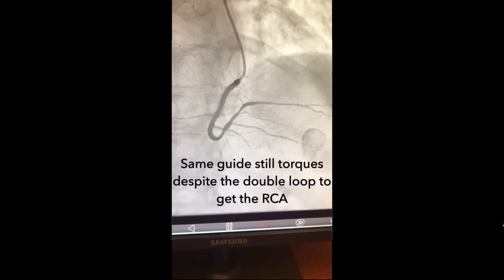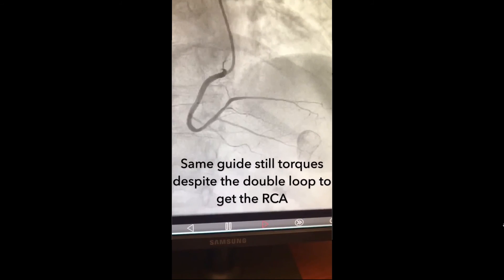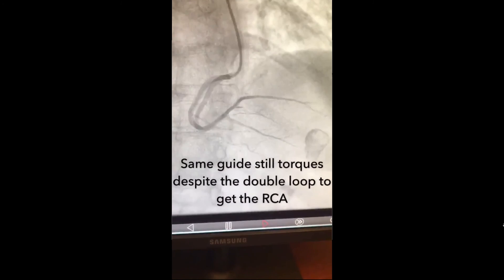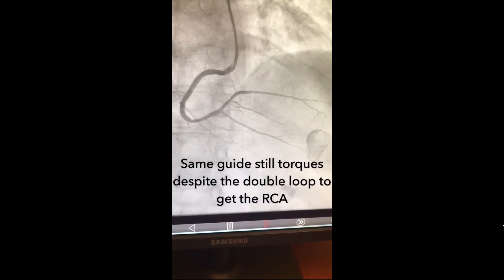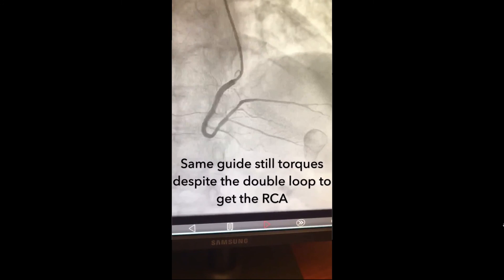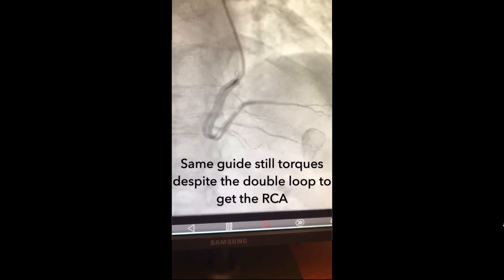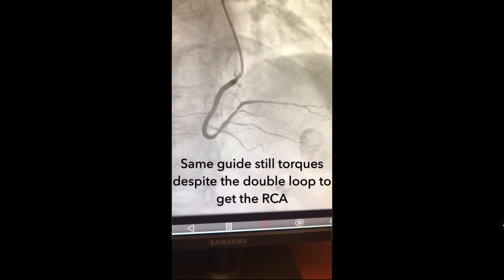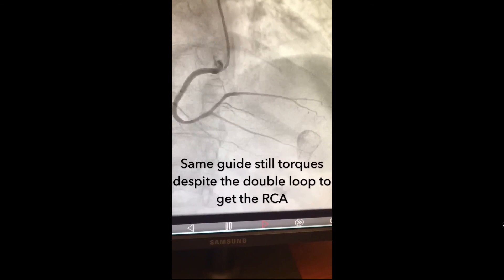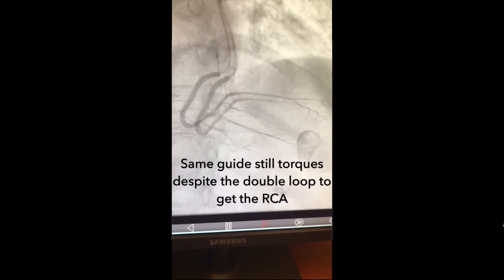One of the tips is to keep the stiff guide wire inside the guide while rotating the guiding catheter. Another trick is to use a 125 or 150 centimeter four-French diagnostic catheter in a telescoping fashion inside the six-French guiding catheter, then rotate.